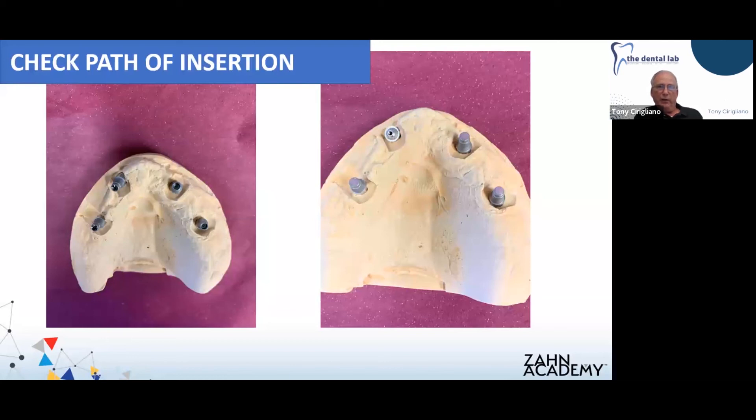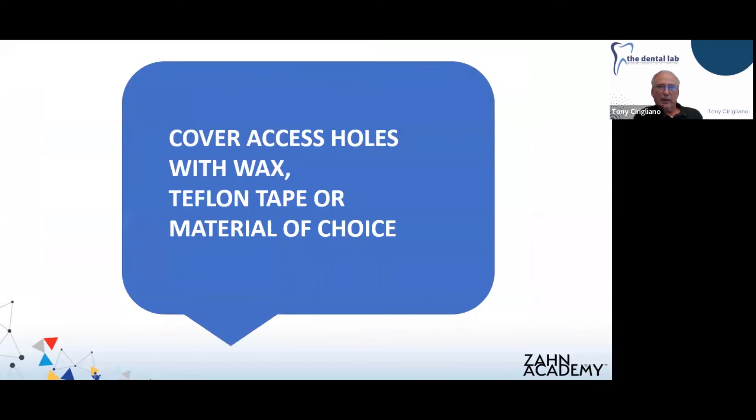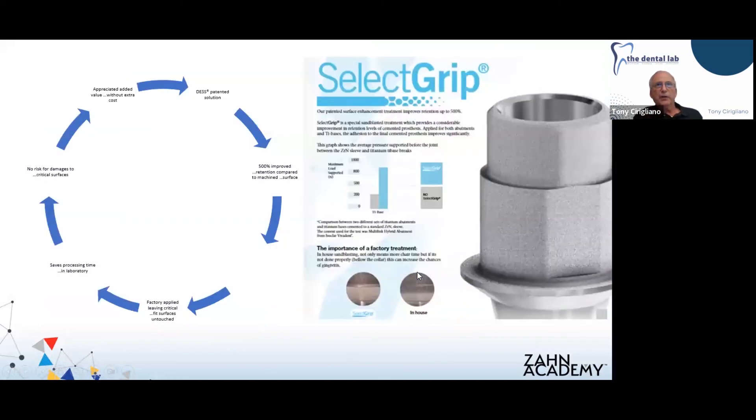We're taking that tie base off the abutment in the number seven area and just going to cover the screw access hole with a little bit of wax. You can use Teflon tape or pretty much anything you normally use to block out access holes when cementing implant crowns. Here's where I want to reiterate the SelectGrip surface texture that DES puts on the tie bases — it really enhances the bond strength, so you can feel more comfortable knowing you're going to have a really good bond.